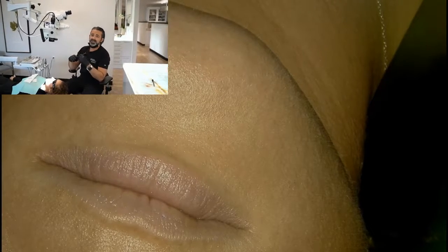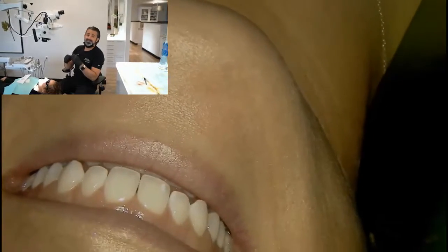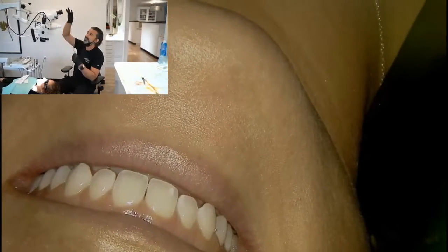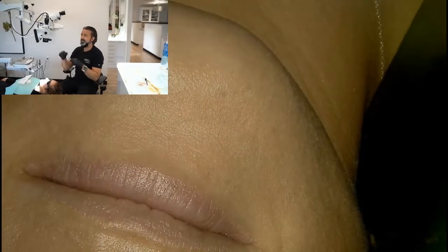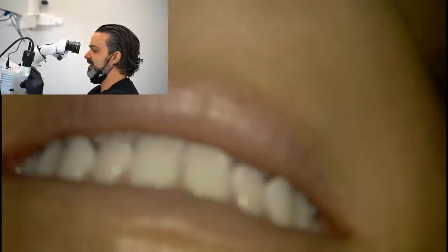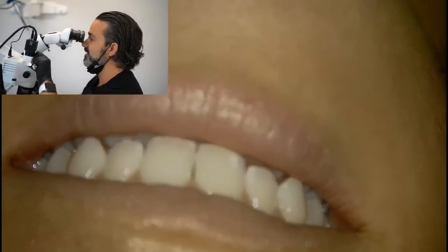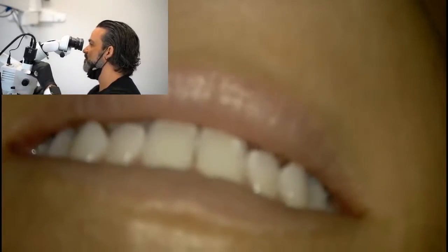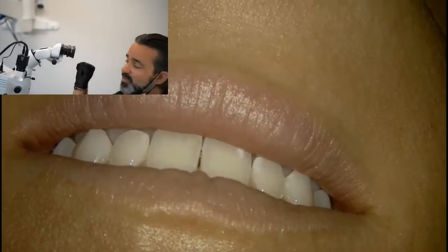Eyelashes, I actually cut my eyelashes, don't tell. I cut them because they drive me nuts. They look pretty, but you flutter your eyelashes on these lens, just like if you were to wear glasses. That gets a little obnoxious. When you're working under a microscope, sometimes you're really wanting to lean in, and when you blink, you get those wispy lines, and you don't really want to keep wiping those things, especially while working on a patient.